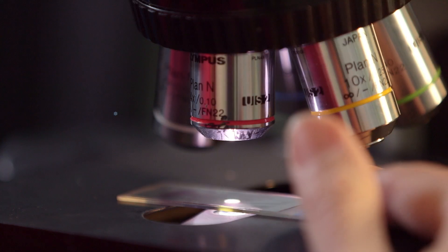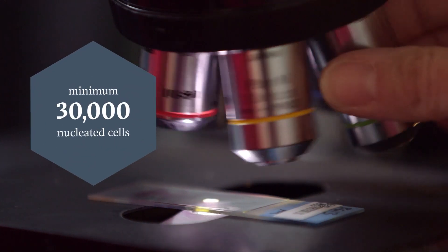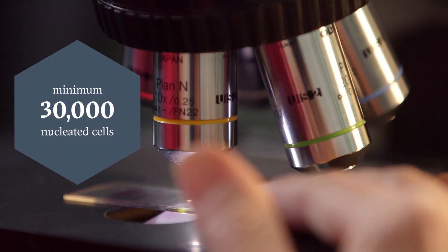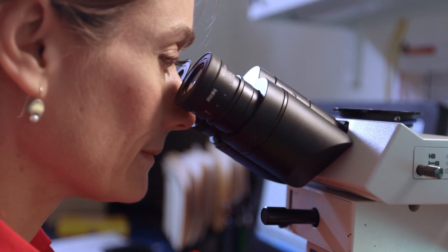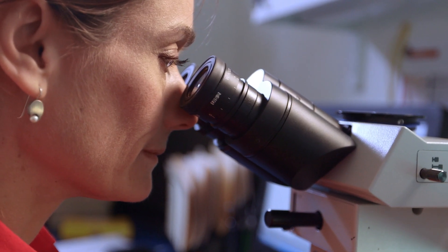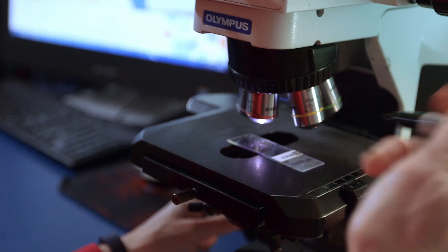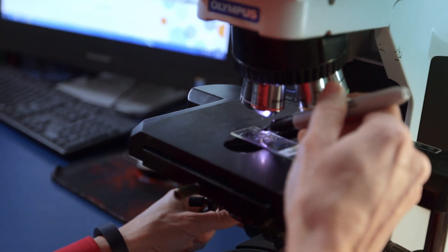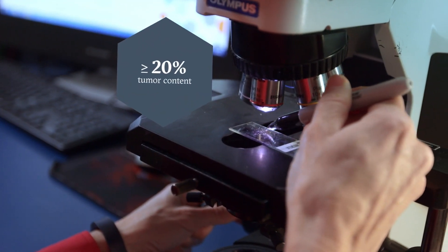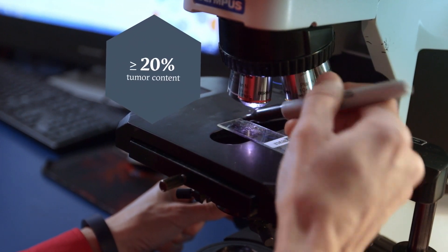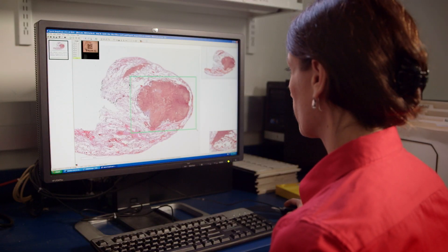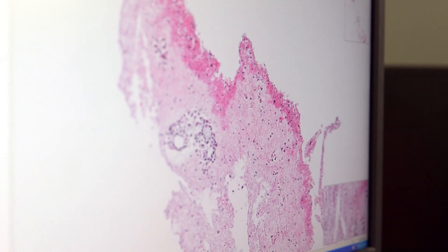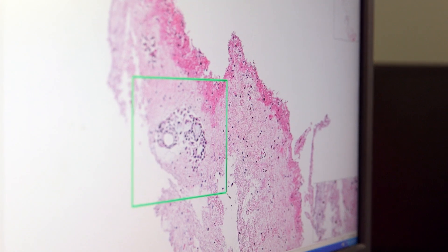A minimum of about 30,000 nucleated cells are needed to extract the 50 nanograms of DNA required to proceed with DNA sequencing. Additionally, the pathologist confirms that at least 20 percent of the total nucleated cells within each sample are tumor cells. This threshold ensures an adequate signal-to-noise ratio of tumor DNA to background normal DNA, which is critical for detecting all classes of alterations, especially gene copy number changes.